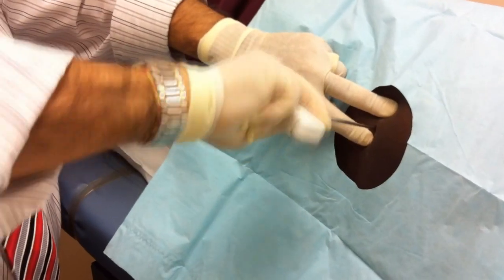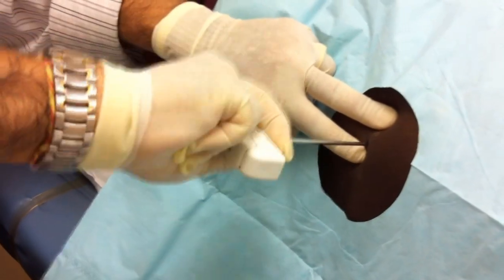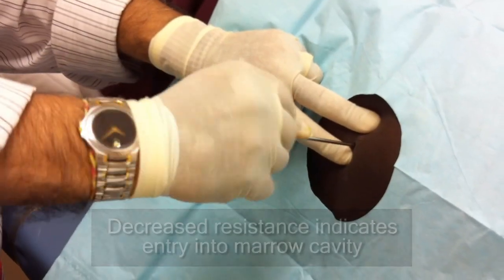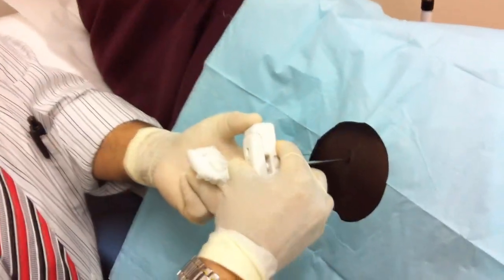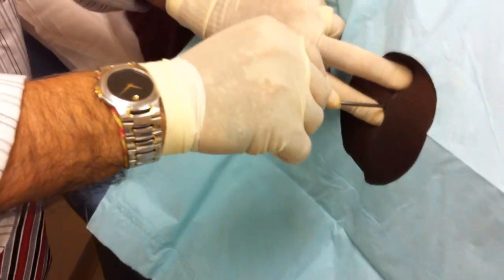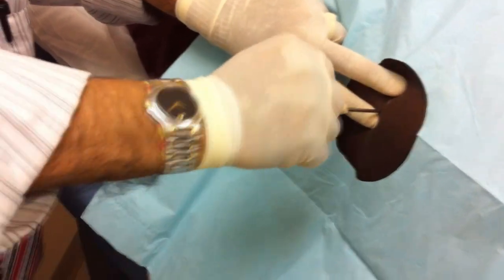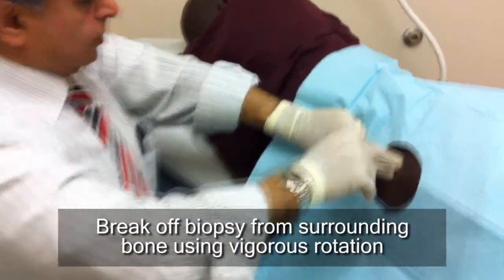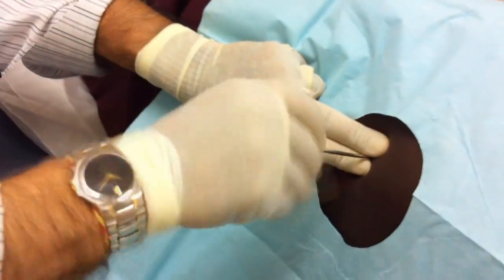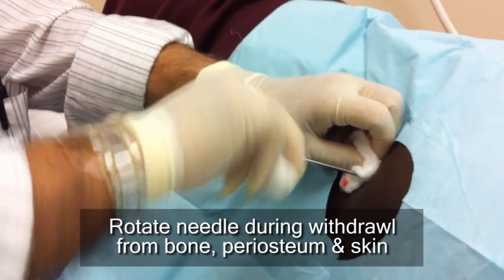Pressure now. Third. I'm going to switch in the front direction. All done. Coming out.